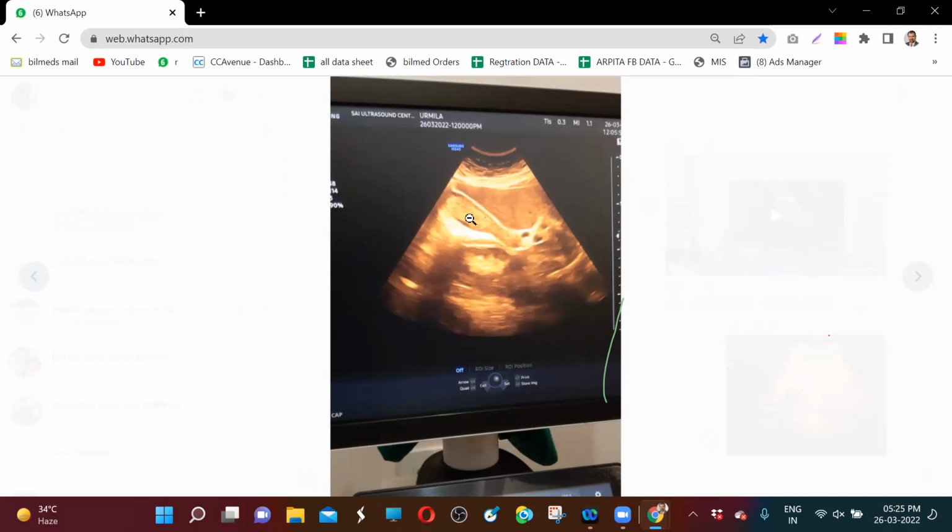Please post in the comment box what that will look like. Shreya, keep an eye on the comment box. Post your answers in the chat box. Everybody, I am repeating, if there is a localized sludge and that sludge is having more density, and with more density it will have more echogenicity, what will that look like?